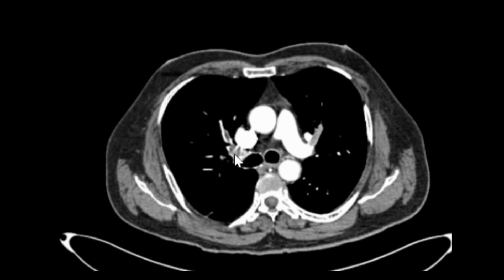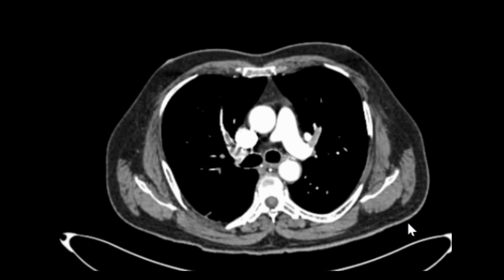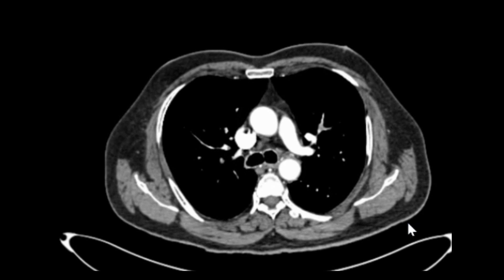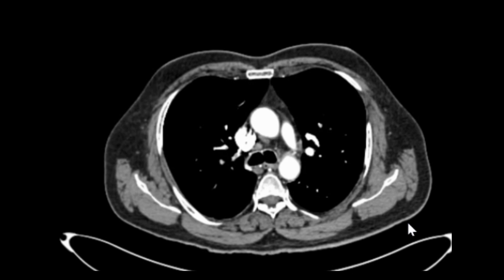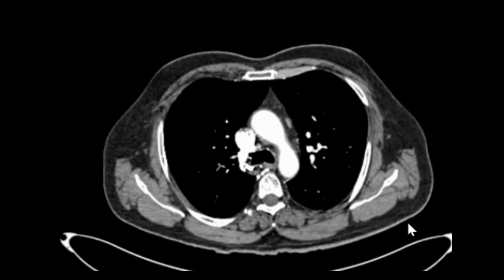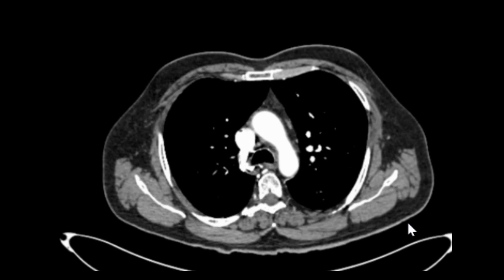This filling defect is nothing but thrombus. Here also we can see incomplete filling of the pulmonary artery branches with thrombi. Now we come up and see the upper lobe branches, above the level of the aortic arch.